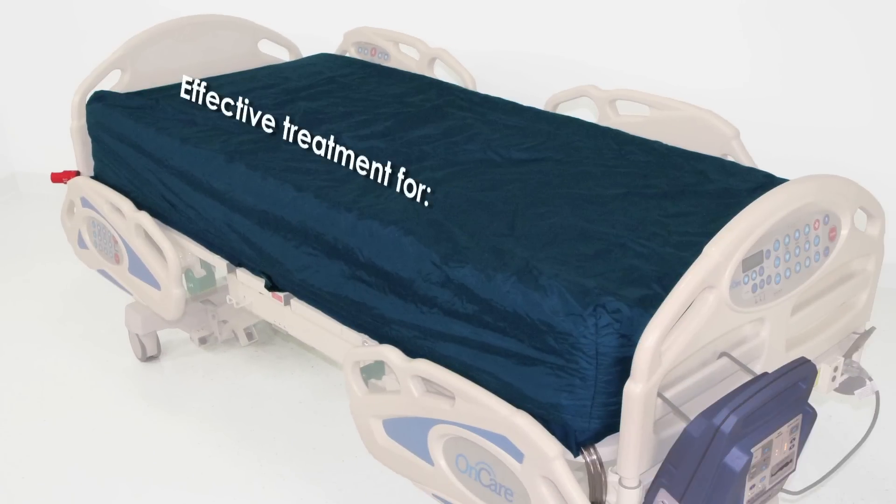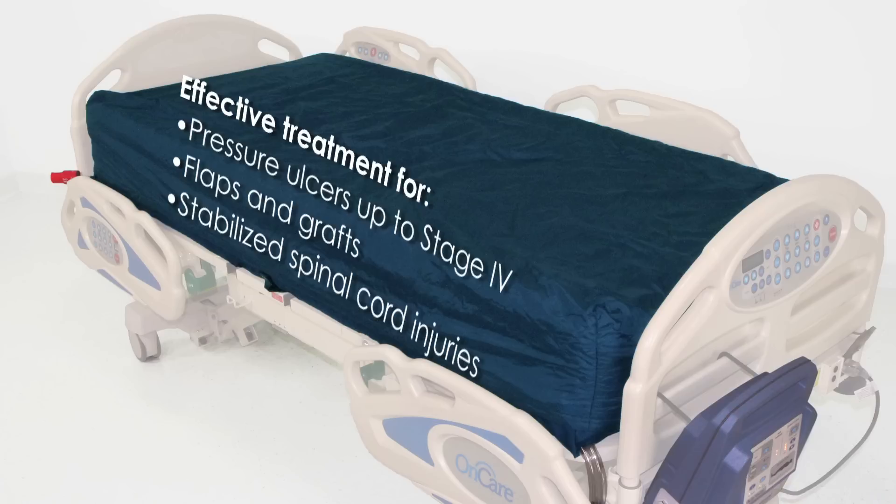As a result, the Dolphin is highly effective for preventing and treating pressure ulcers up to stage 4, as well as treating patients with flaps and grafts and those with stabilized spinal cord injuries as directed by a physician.